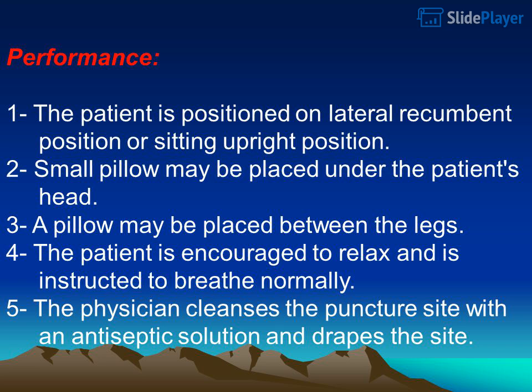Performance: 1. The patient is positioned in the lateral recumbent position or sitting upright position. 2. A small pillow may be placed under the patient's head. 3. A pillow may be placed between the legs. 4. The patient is encouraged to relax and is instructed to breathe normally. 5. The physician cleanses the puncture site with an antiseptic solution and drapes the site.